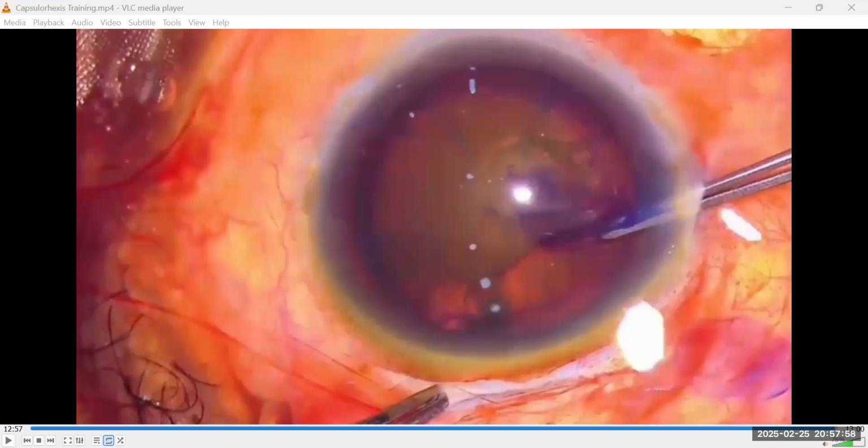I tell my residents, go get a wet lab and put it in your house. Put a wet lab in your house. I don't have a microscope. Yes, we know microscope is expensive, but a trial frame is not expensive. Take up a trial frame, go and pick +3, +2, or +2.5 and put there. All you need is magnification. Let your spouse or whoever you stay with or your kids hold a torchlight for you. Let them be part of your training.